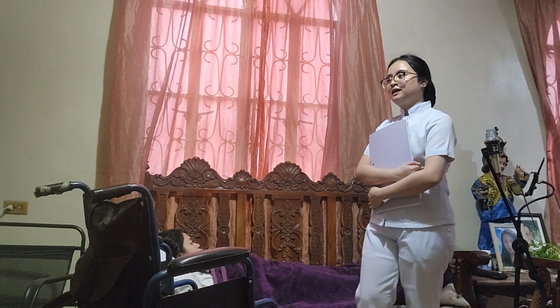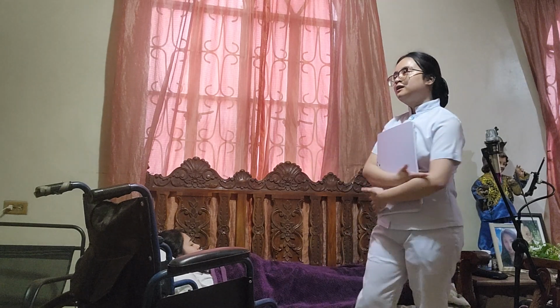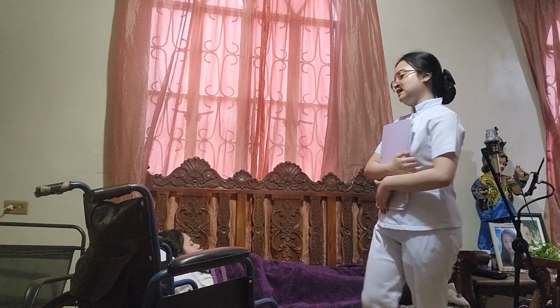Afternoon. I'm Eliza P. Cordova from BSN M3B, and for today, I will be demonstrating how to transfer a patient from the bed to the wheelchair and vice versa.